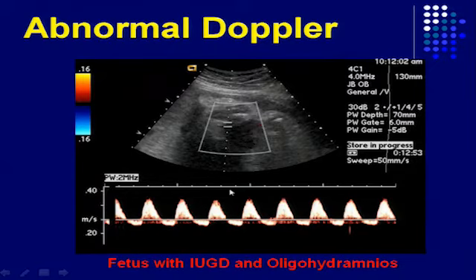This one went from the ultrasound room up to labor and delivery. And that baby was growth delayed and did have oligohydramnios. So the reason we do these, once a week or sometimes twice a week, is depending upon maternal complications, their clinical history. What are their clinical symptoms? What's going on?